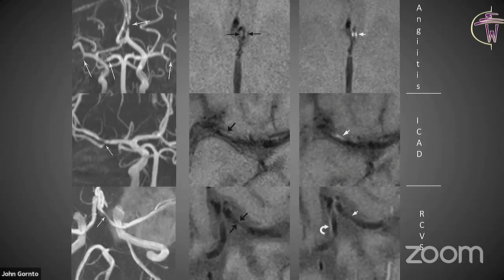You can see multifocal stenoses and intense circumferential enhancement involving that ACA segment. For atherosclerosis in the middle row, that MCA bifurcation lesion, you can see the lesion along the anterior wall of the artery. It's eccentric, it's outward remodeling, and it shows heterogeneous enhancement. And then the RCVS case in the bottom, in the involved segment, the left A1, there's not much wall thickening that we can see. The enhancement along the right A1 is actually periarterial venous enhancement. When we imaged in the coronal plane, that enhancement went away.